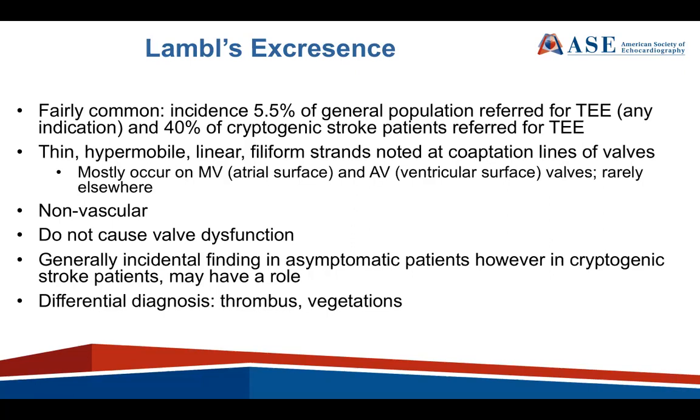Most commonly occur in the mitral valve, the atrial surface of the mitral valve, and the ventricular surface of the aortic valve. Rarely do they occur elsewhere. Again, they're also non-vascular. They do not cause valve dysfunction. And again, they can be an incidental finding in asymptomatic patients, but they can be the source of stroke in patients who are being evaluated with TEE.